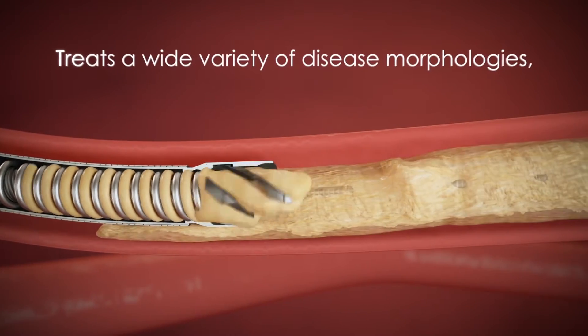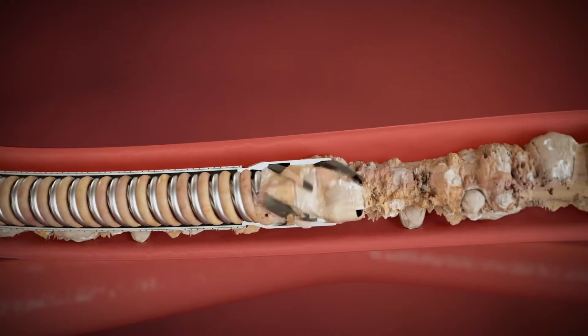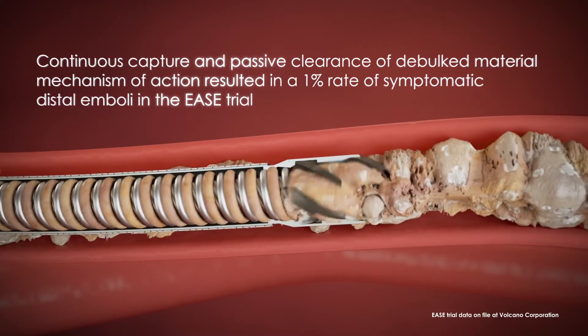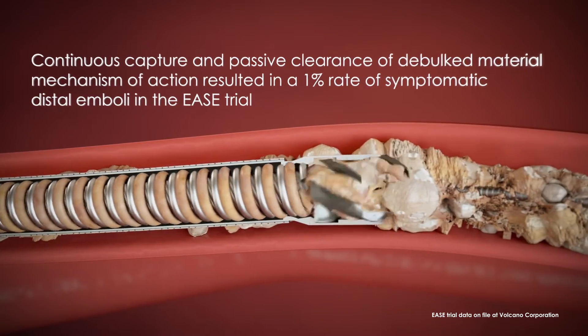Phoenix treats a wide variety of disease morphologies, from soft plaque to calcified arteries. Its continuous capture and passive clearance of debulked material mechanism of action resulted in a 1% rate of symptomatic distal emboli in the EASE trial.